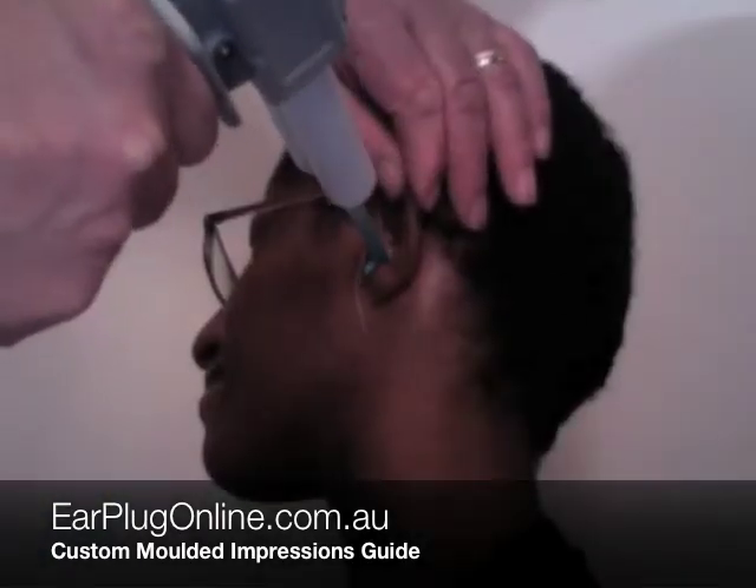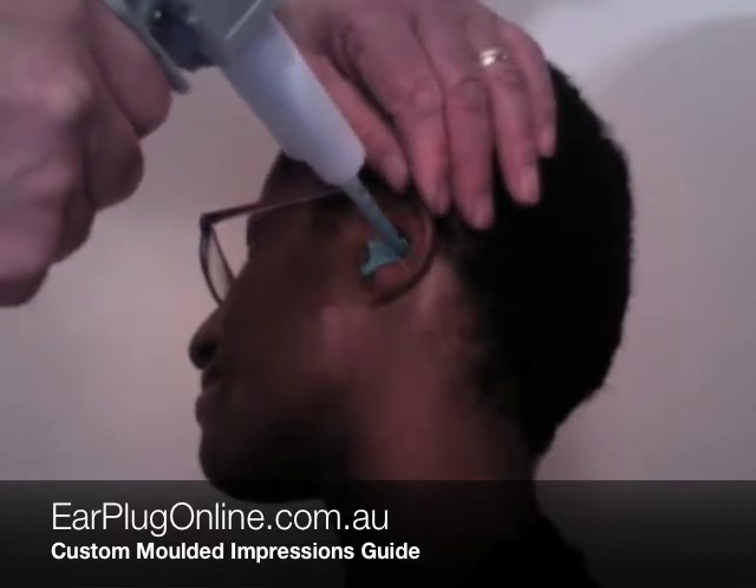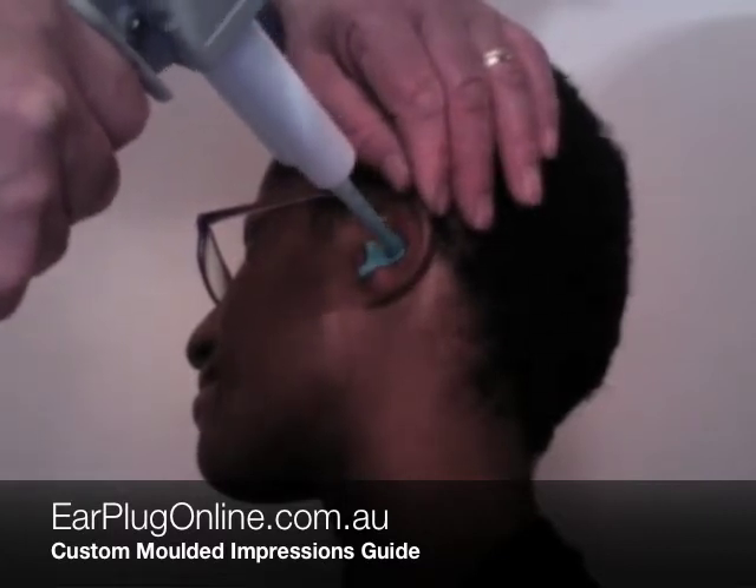A silicon impression material is injected into the ear canal and outer ear. This takes approximately 5 minutes to set.